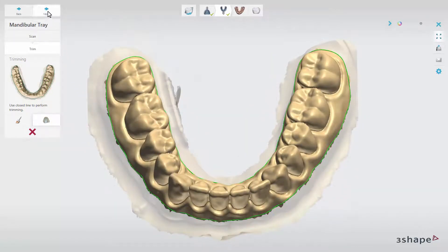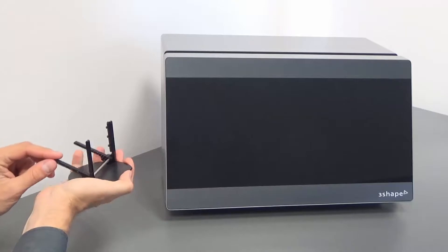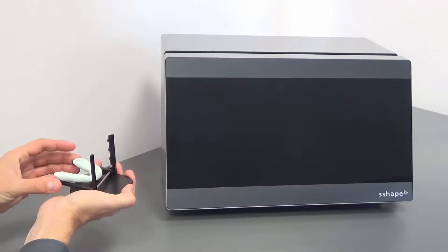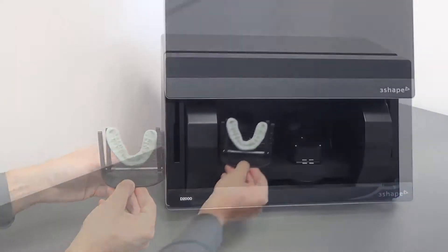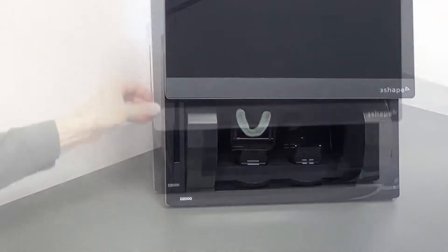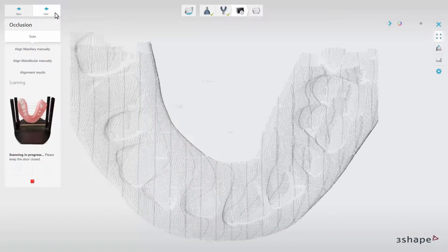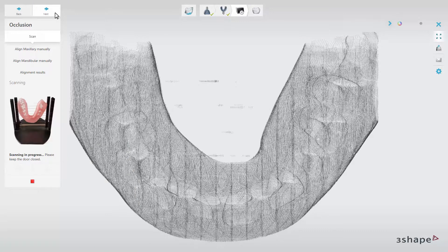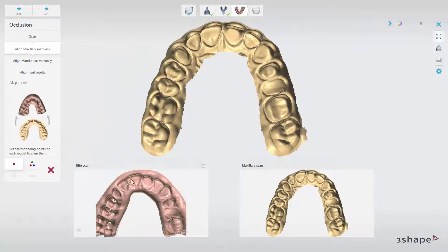Once the scans are ready, click Next for occlusion scanning. Insert the bite registration, fitted in the wax-up fixture, into the scanner. The upper arch side should be facing into the scanner, and if you use the D2000, place it on the left plate. Then click Next to start scanning. When the bite has been scanned, click Next to have the possibility to do alignment of the upper jaw scan.